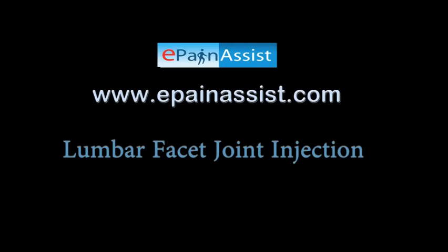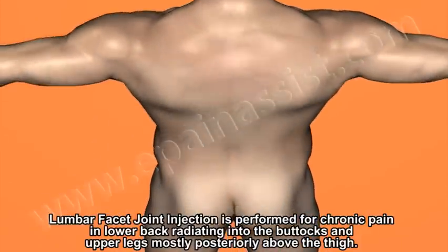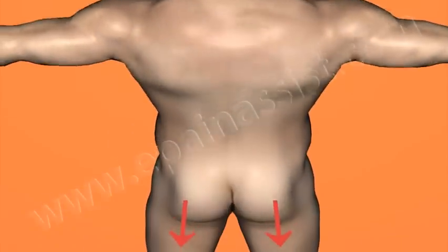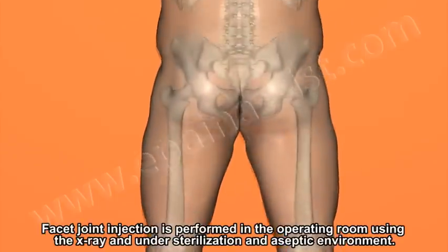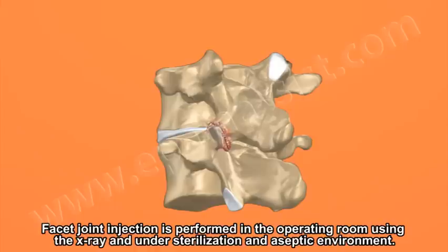Lumbar facet joint injection. Lumbar facet joint injection is performed for chronic pain in the lower back, radiating into the buttocks and upper leg, mostly posteriorly above the thigh. Facet joint injection is performed in the operating room using X-ray and under sterilization and an aseptic environment.